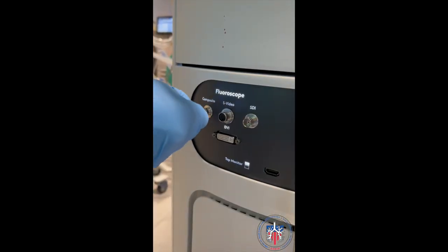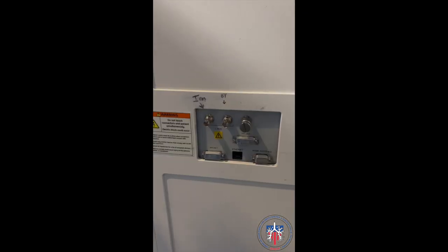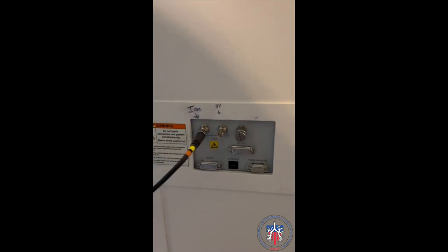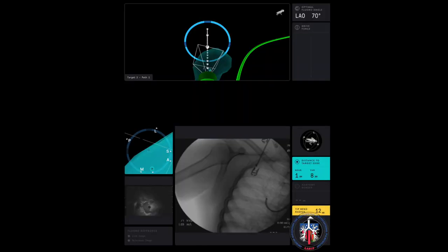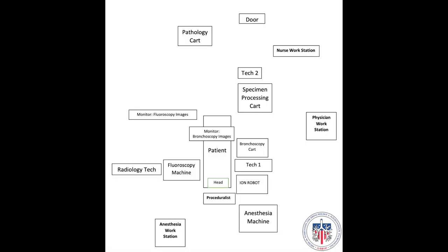Next, the fluoroscopy equipment is connected to the robotic console for visualization of live fluoroscopic images during the procedure on the robotic monitor. In this video, the GE 2D fluoroscopy equipment is depicted as an example. Properly connected, the robotic monitors will allow visualization of radial probe and fluoroscopic images simultaneously. Navigation can now begin. Shown here is one example of the overall room setup for ion robotic bronchoscopy procedure.